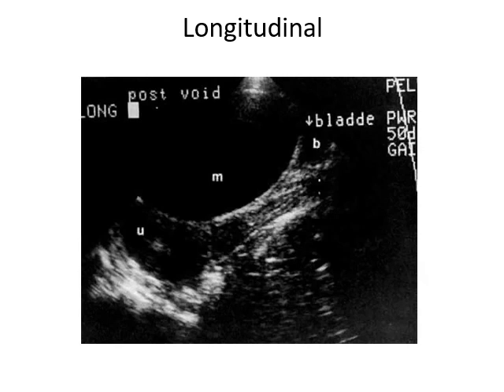All right, so this will be the uterus. Actually, it's a she. I shouldn't have said he. The uterus here, and then you see the bladder here. This is telling you it's post-void, so this person had to actually pee out all their pee. All right, so this is the longitudinal. This is really hard to explain in 2D. With ultrasound images, I have a hard time getting my mind to think in 3D while looking at a 2D picture.